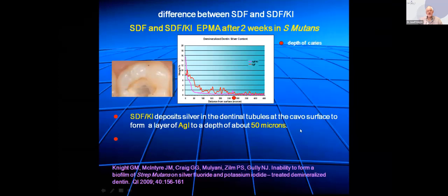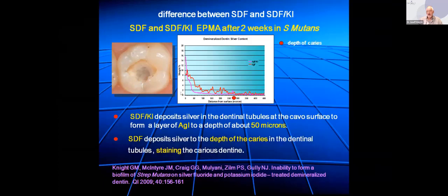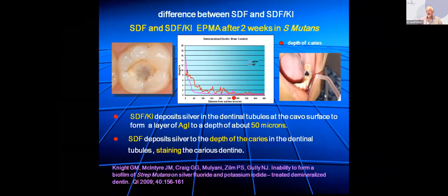And so when you're using Reva Star, you look at the surface and you'll see the caries suddenly has this fuzzy white appearance, which is the creamy white silver iodide on the surface. However, when you're looking at the silver diamine fluoride, you see it's penetrated right into the depths of the caries, and those little spikes show it's actually in the dentinal tubules. Now, of course, when you put on silver diamine fluoride, the lesion goes black because the silver precipitates out eventually, and that's a dark stain.